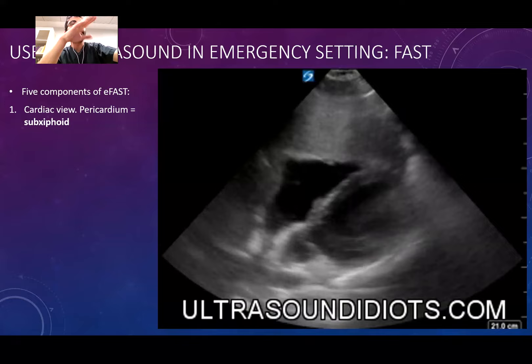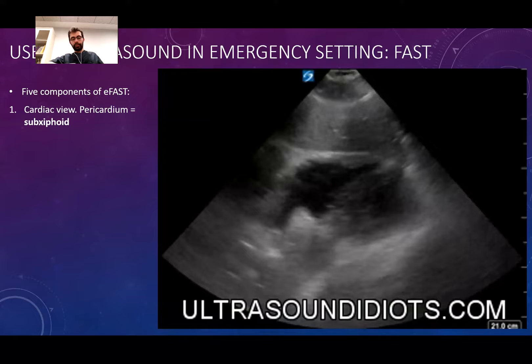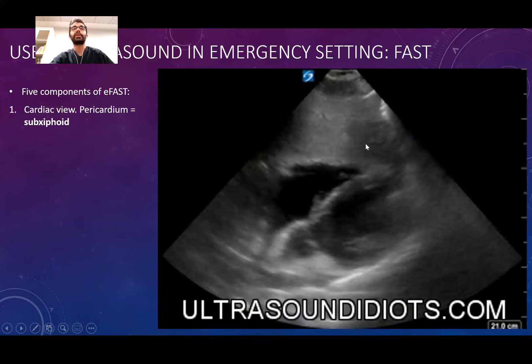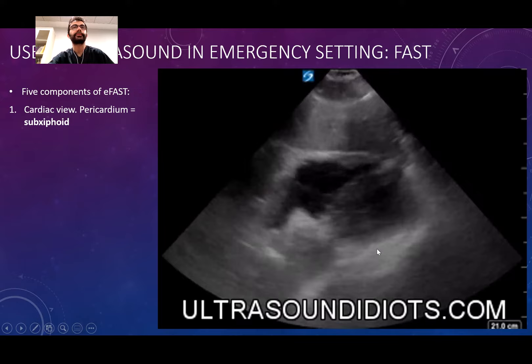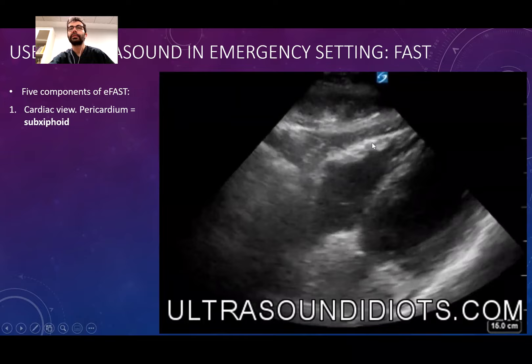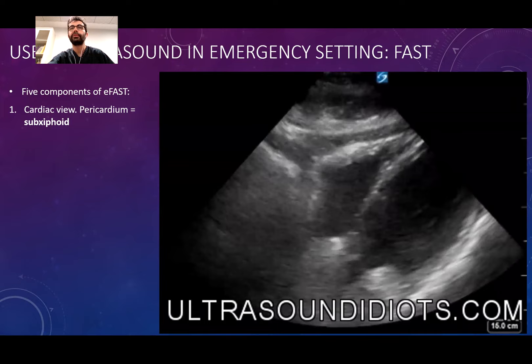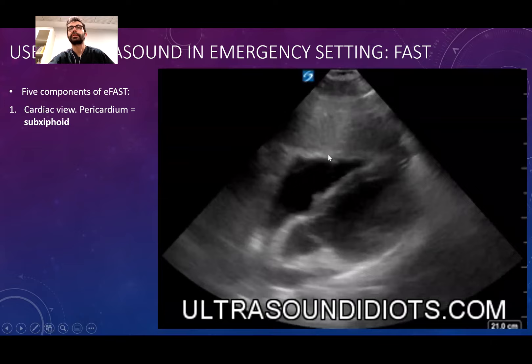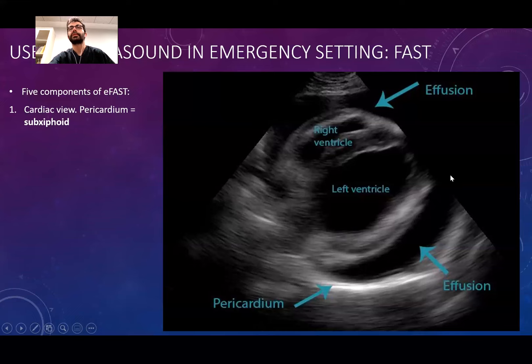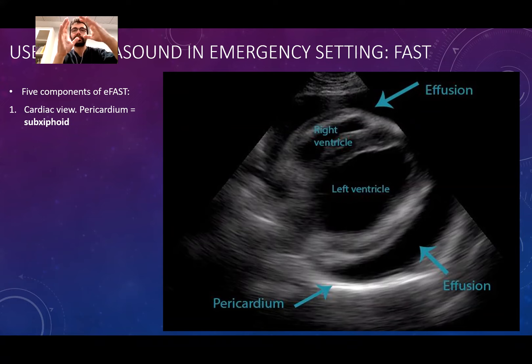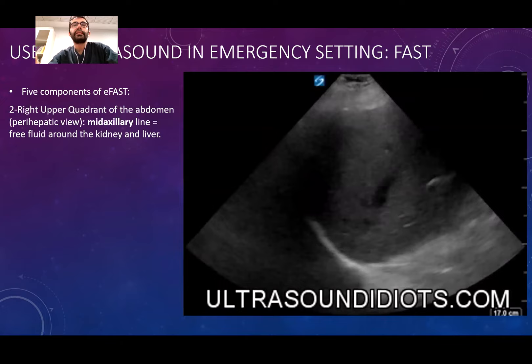When you put the probe in the subcostal area and angle upward, you can see the heart beating and the liver in front of it. In a normal image you see just the heart walls. When there is free fluid around the heart, the heart starts to shake a little, and you can see a small amount of free fluid in front of the heart. As the fluid increases it can be seen more clearly and the heart will start to swim inside it.